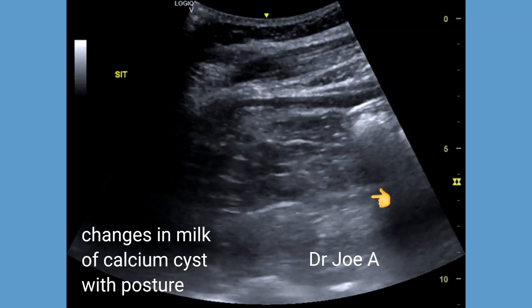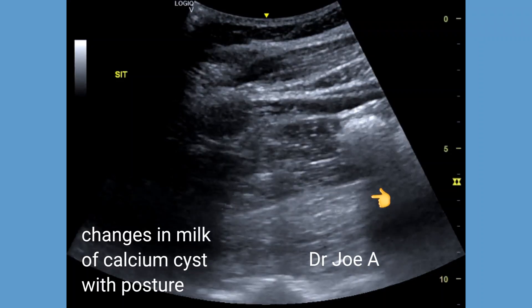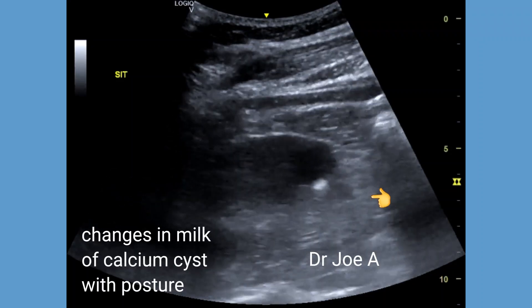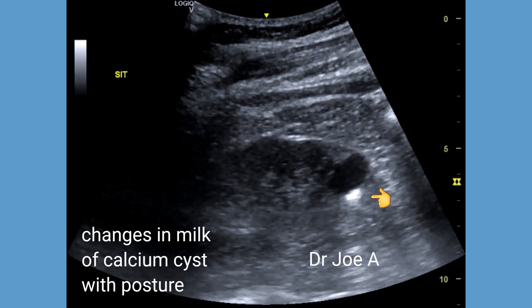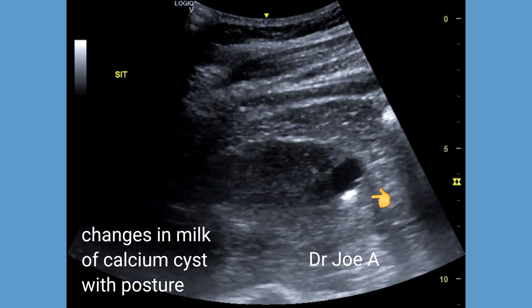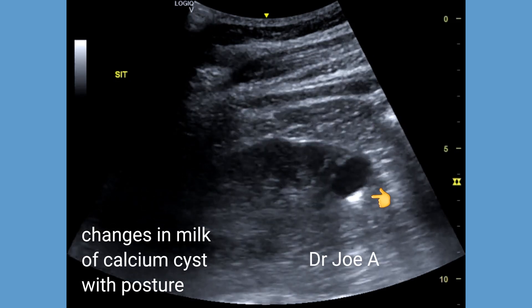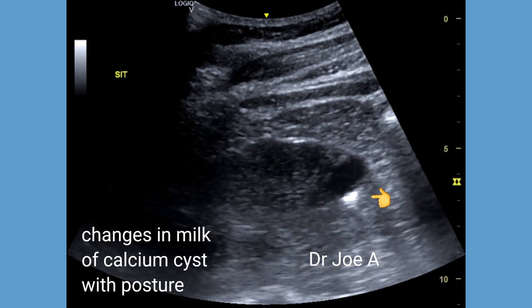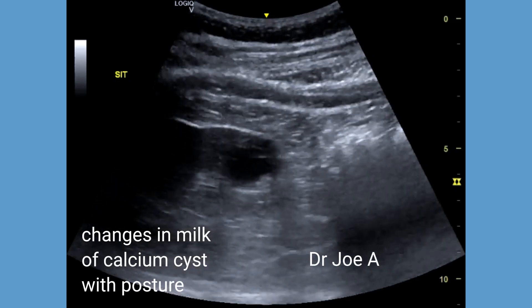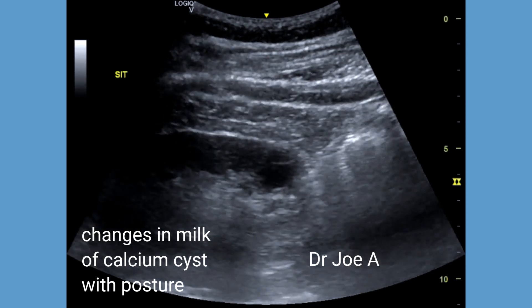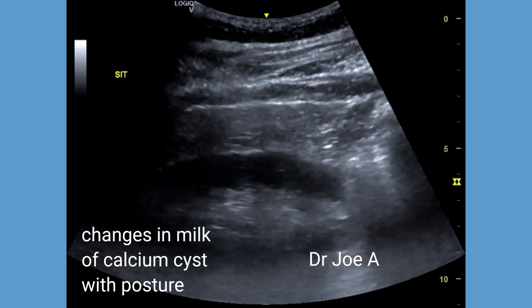This simple cyst of the right kidney contains a colloidal suspension of calcium salts, which is called a milk of calcium cyst.